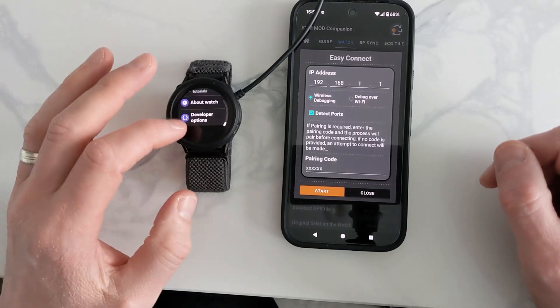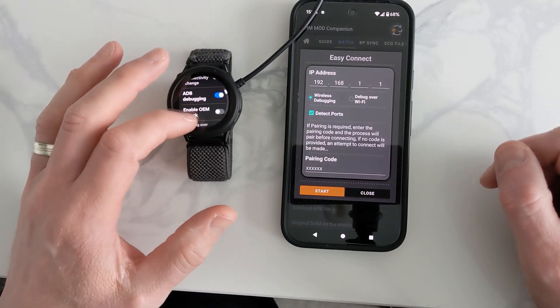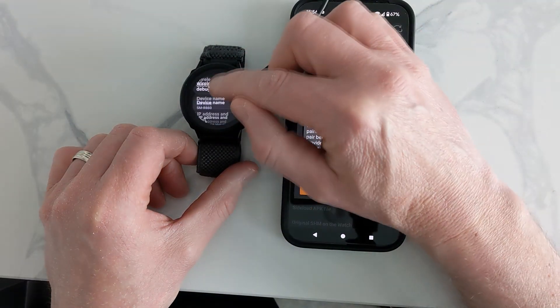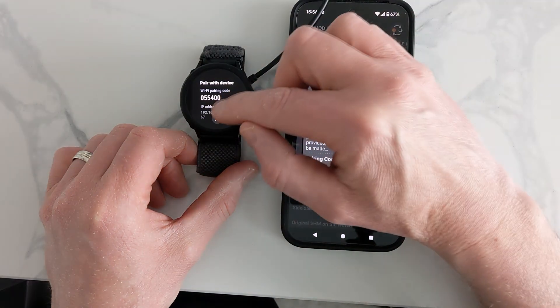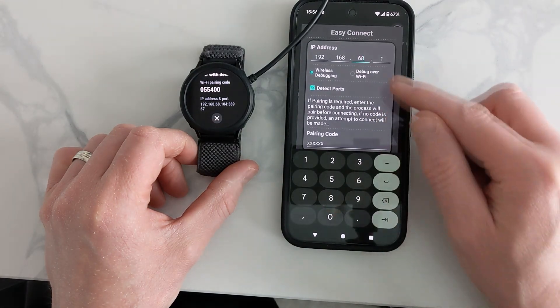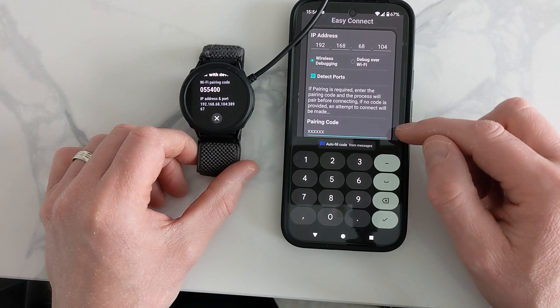On the watch, go back to Settings, scroll down to Developer Options, and this time go to WiFi Debugging and turn that on. Then select 'Pair a New Device.' It will give you the IP address and the pairing code. Fill those in — mostly the last two digits of the IP — and your own pairing code will be different so make sure you enter yours.